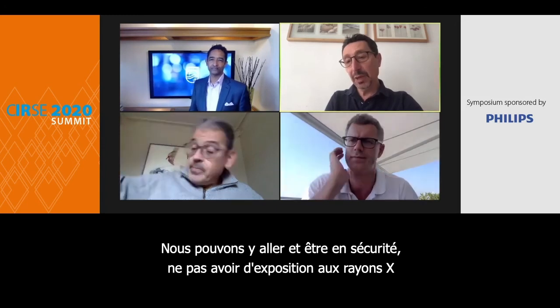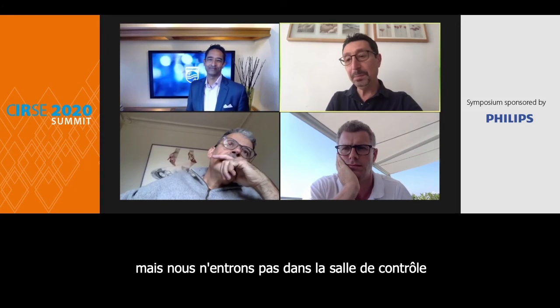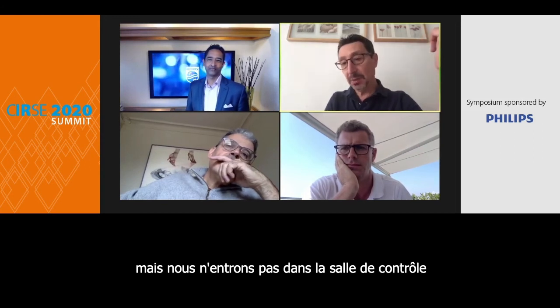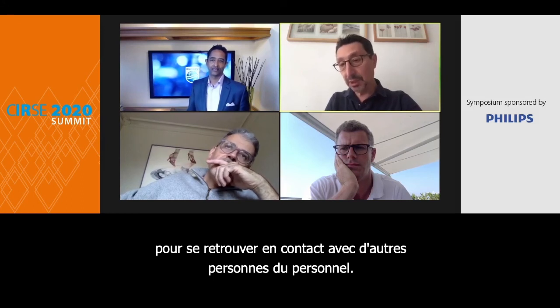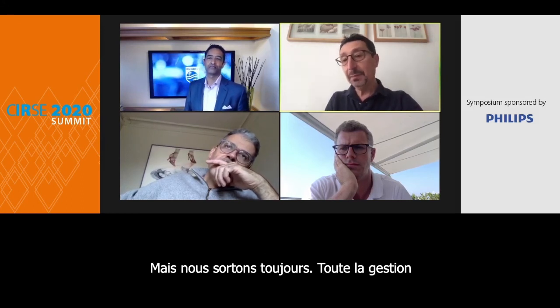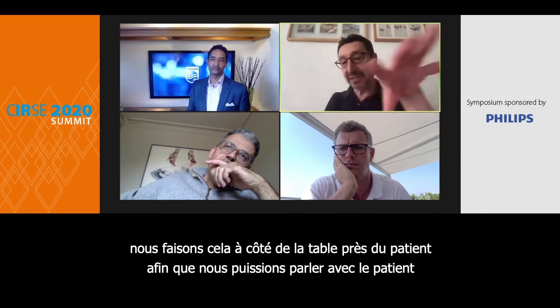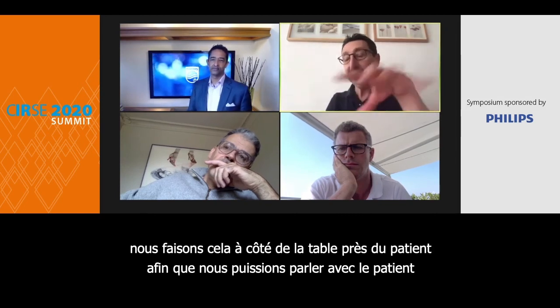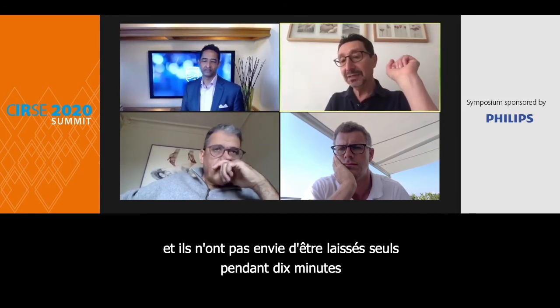We can be secure, without any X-ray exposure, but we don't go into the control room and be in contact with other staff. But we always go outside. All the management, we do at table side near the patient, so we can talk with the patient and he doesn't feel left alone for 10 minutes.